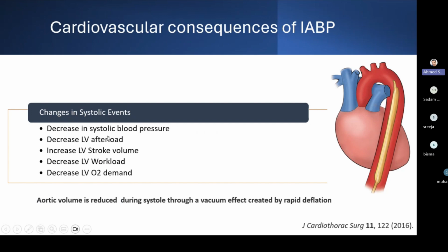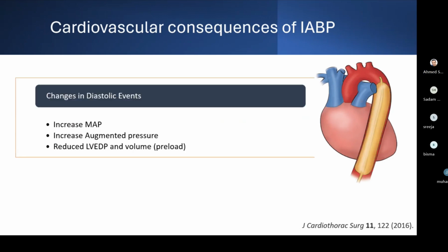And also reduction of the afterload and systolic pressure, both of them at the same time, will lead to decrease of the workload that should be done by the heart to overcome the afterload. And consequently, this will lead to reduction of the left ventricle oxygen demand. So all these are the changes related to the systolic event.